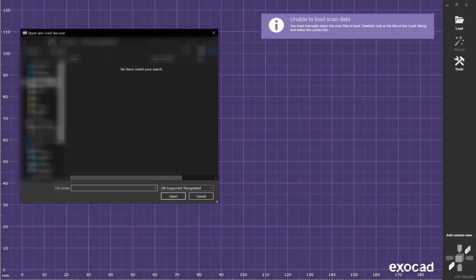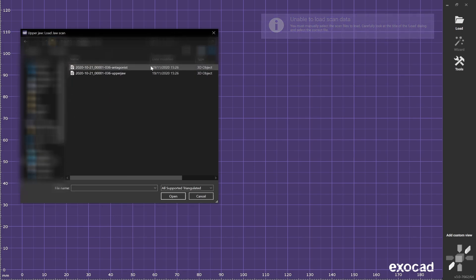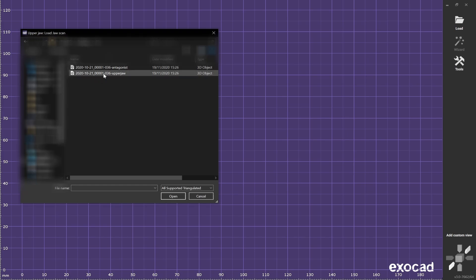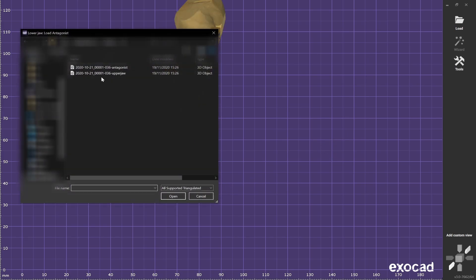Now the software is going to ask you to bring up the scan files. First it asks you to bring up the upper jaw. So select the upper jaw and press open, and the lower jaw open.